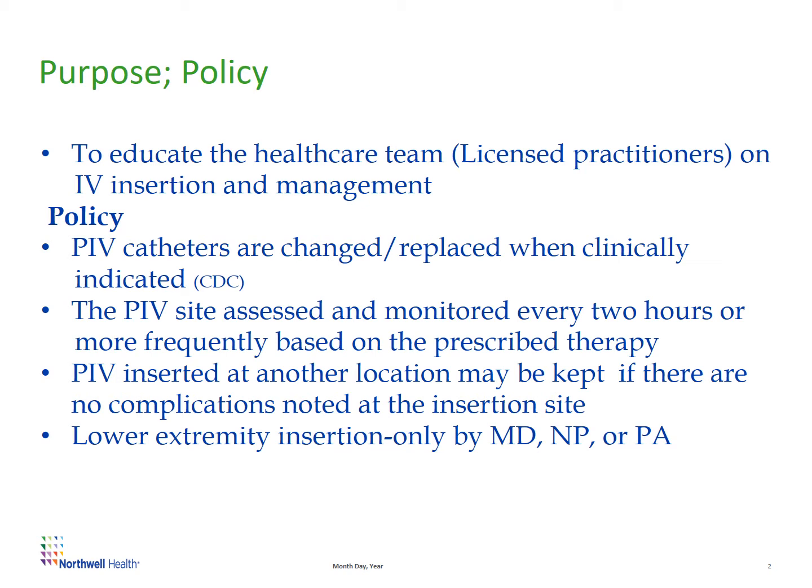Now, most often, RNs are allowed to insert IVs only on the upper extremities. The lower extremity insertion, in very, very rare circumstances, can only be done by a licensed provider, such as a physician, a nurse practitioner, or a PA.